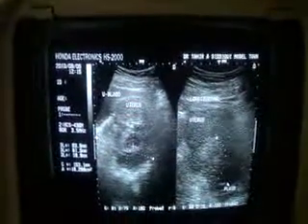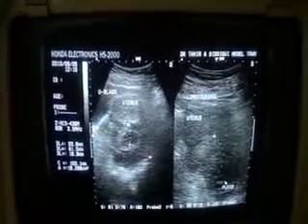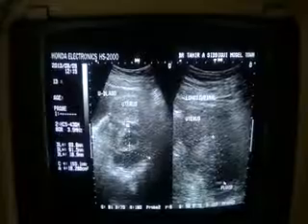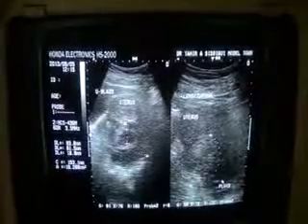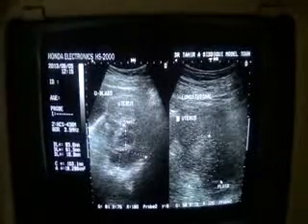This is an ultrasound study of a female presenting with a history of amenorrhea for the last 2 months, and now having spotting, with a positive pregnancy test and raised beta HCG level. What we see is the longitudinal section on the right hand of your screen.